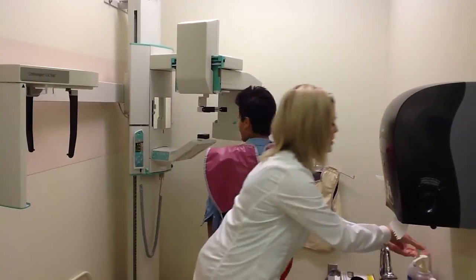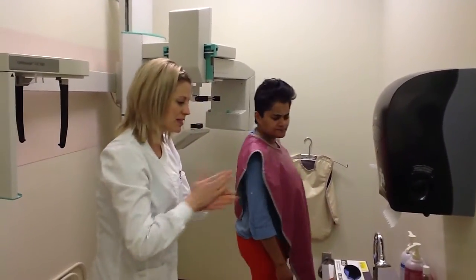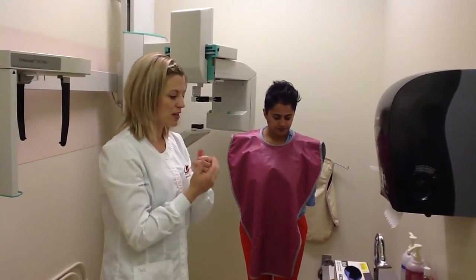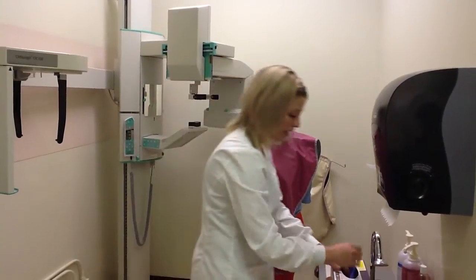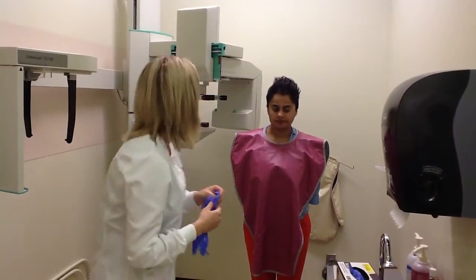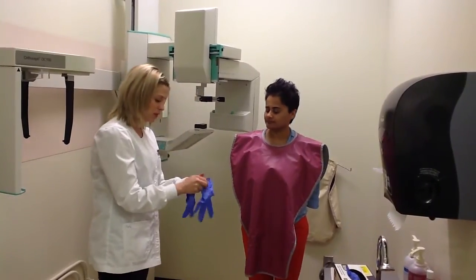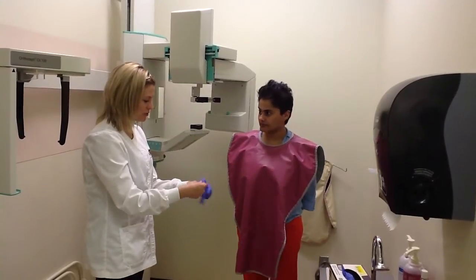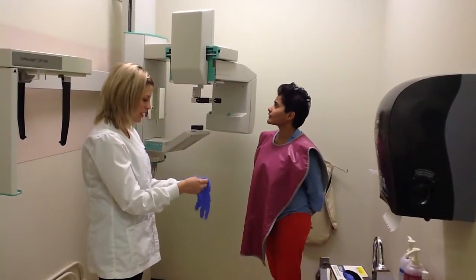Excellent. At this point I'm going to place my PPE. What's required during a pan exposure would be gloves, and safety glasses and a mask are optional. Okay, so I'm going to explain the procedure, or what to expect before we begin, so you have an idea.